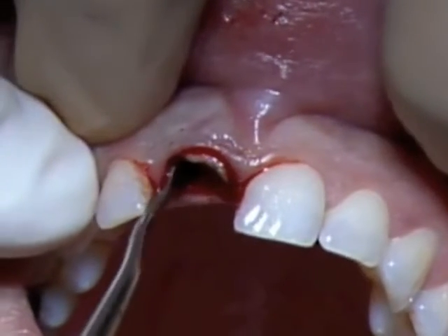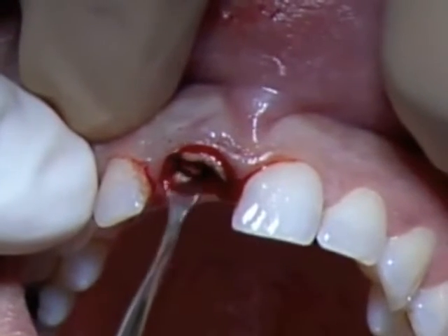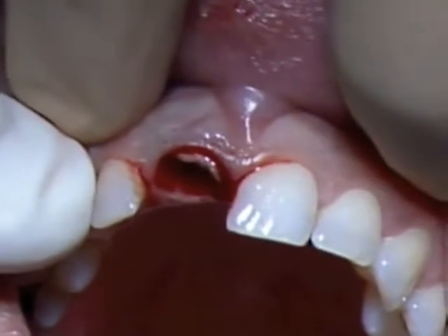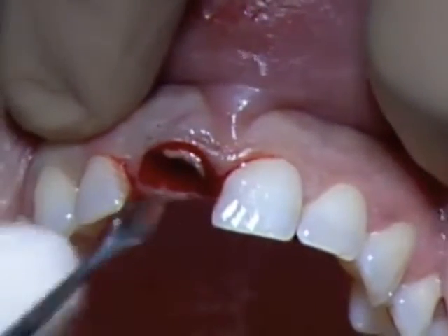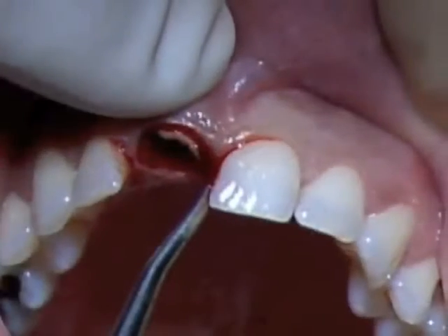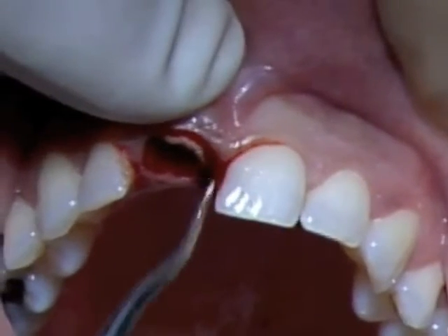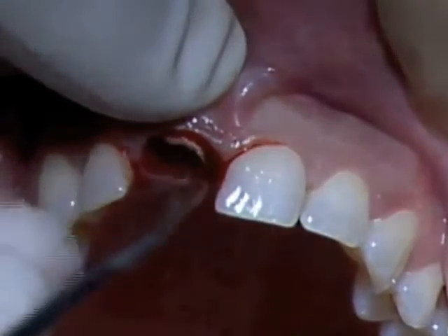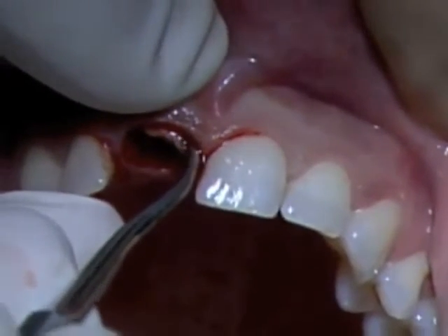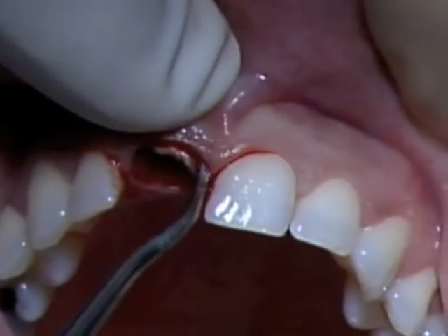It is very important to understand that it usually takes us longer to extract the fractured root than to place the implant. So we will then extract also the buccal part of the root. You see here we can go quite deep mesially where the defect is, and finally mobilize the buccal part of the root as well.